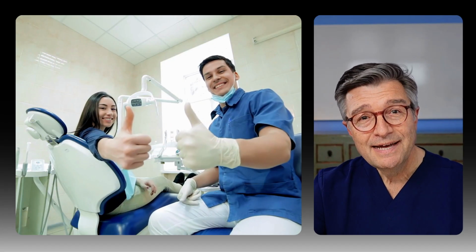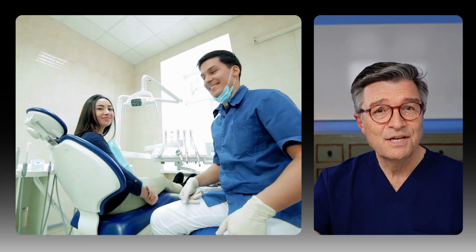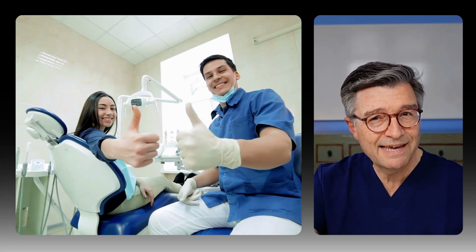They don't show us the face, the smile, the soft tissues, how the patient looks and feels, how the patient moves, speaks, or smiles in real life. And in an era where patients demand aesthetic excellence, functional harmony, and personalized care, relying only on radiographs is simply outdated. We must accept that modern diagnostics require multiple perspectives.